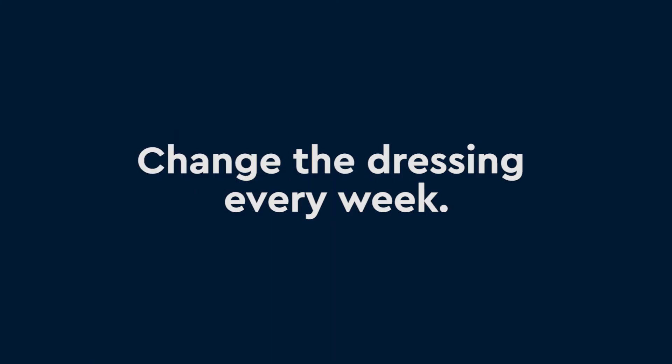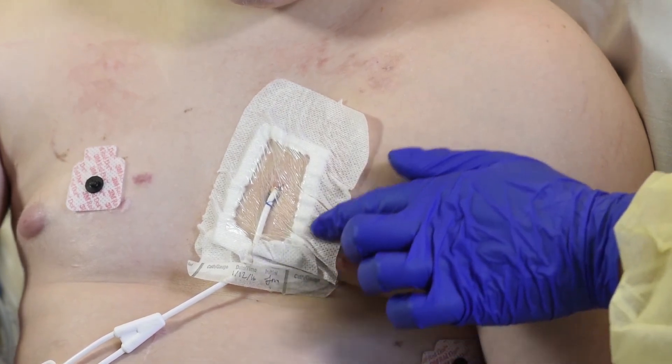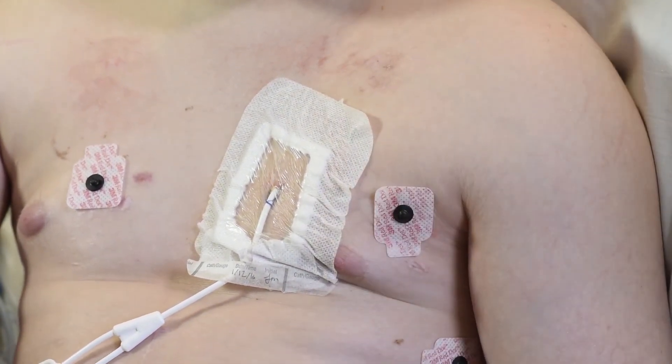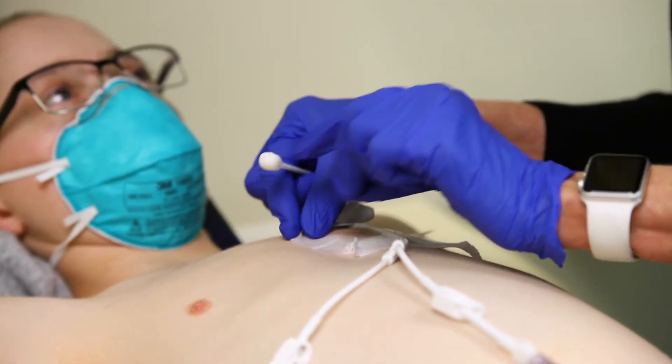The dressing needs to be changed every week, or sooner if it gets wet, dirty, or peels off. If the border of the dressing is peeling but most of the dressing is intact and sticking well to the line, you do not need to change it until the week is over. If the dressing is peeled in the clear window, change it right away.